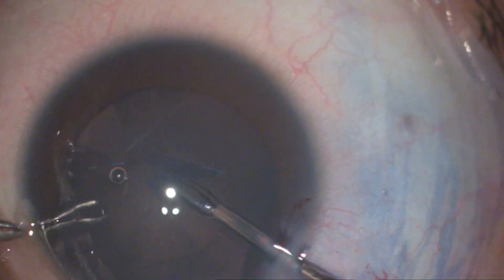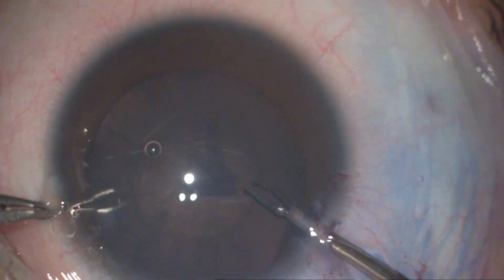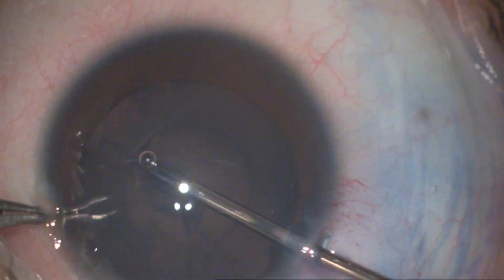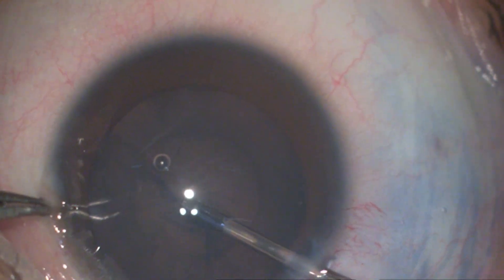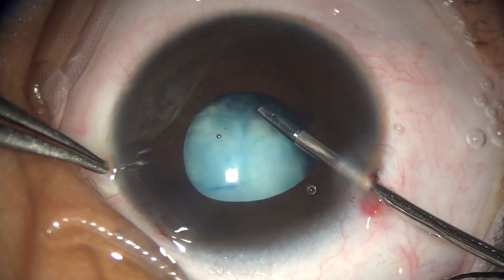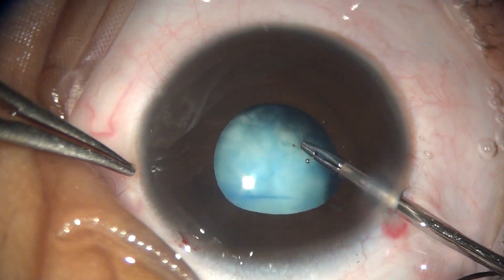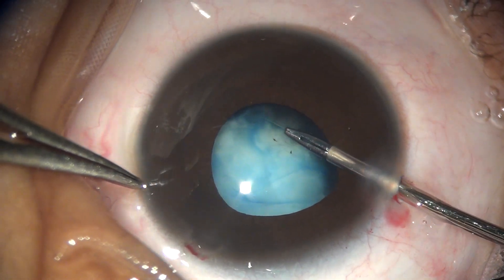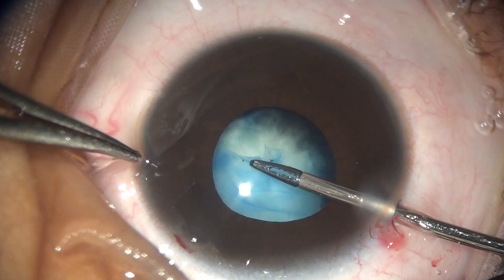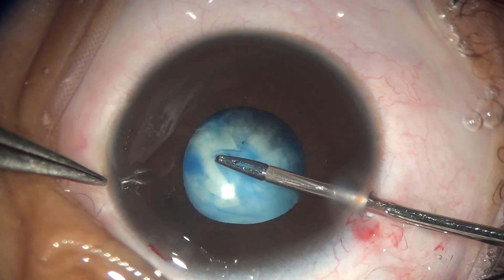This has a steep learning curve. For proper centration of the intraocular lens, anterior capsulotomy should be smaller than the IOL optic. If the capsule begins to extend to the periphery, stop before the edge is out of sight under the iris, re-grasp the edge, and pull directly toward the center of the pupil to recover the tear.